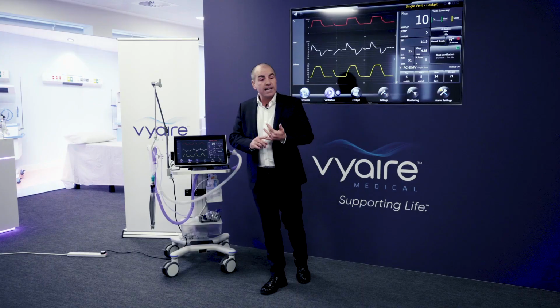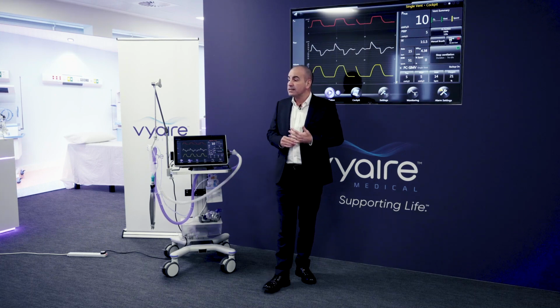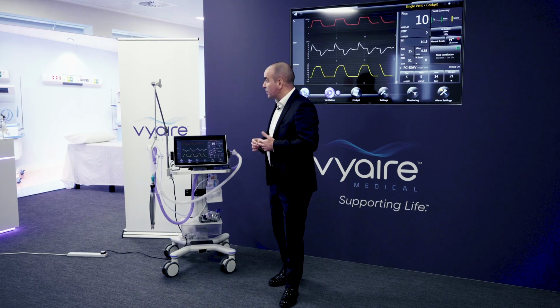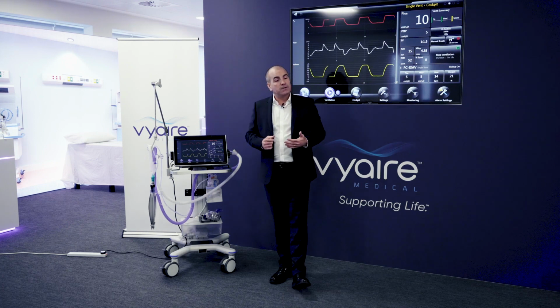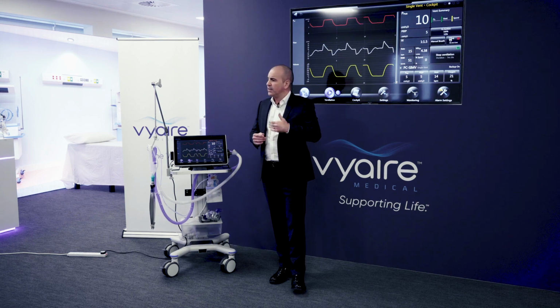We have the bellavista Neo, which is a device dedicated for neonates. We have the bellavista 1000 and we have the 1000E. Essentially, they all run on the same platform, but the 1000E comes fully spec'd with the most comprehensive suite of software. There's only a couple of extra features that you can potentially take as an add-on.